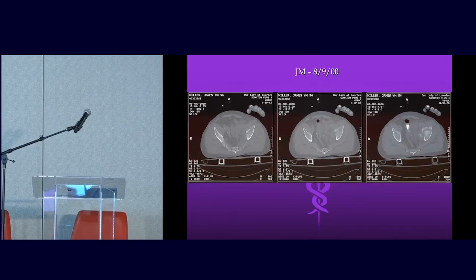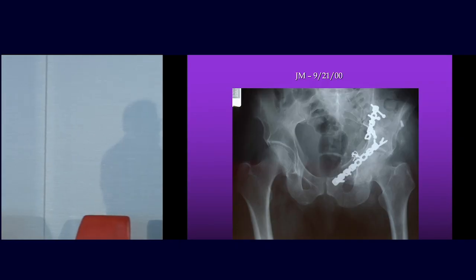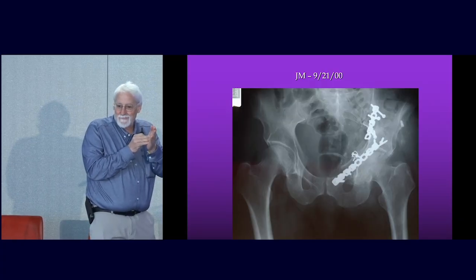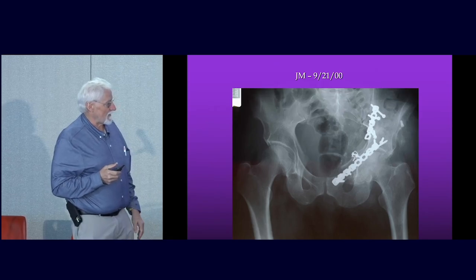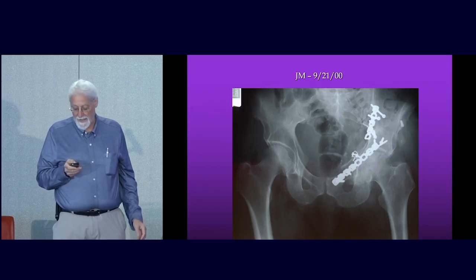This guy, he also had a shoulder glenoid fracture at the same accident. So I took him to surgery. This is in 2000. And you see, you know, when you start seeing cerclage wires here, I was trying everything. And I fixed it, and the bone was still moving. I'd push it, and I'm like, I can't do a total hip in this guy. And so I woke him up, and I said, I didn't fix it that great, and I did everything I can, but your bone is too bad.